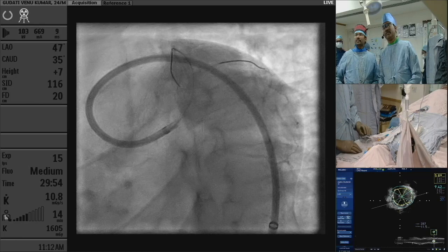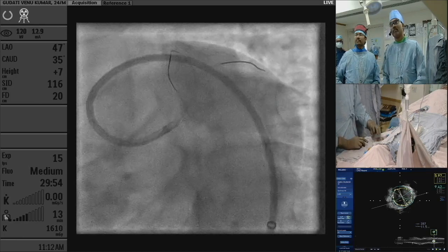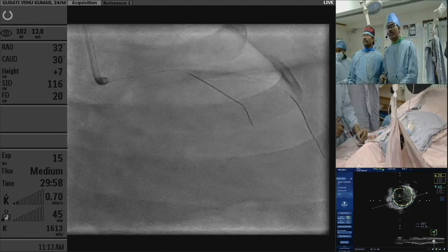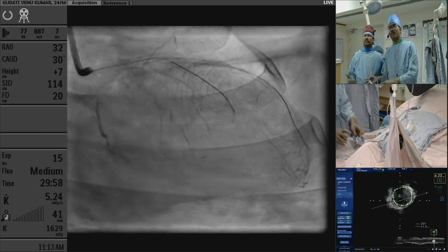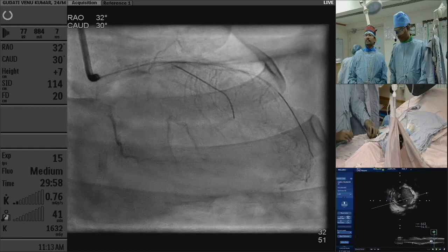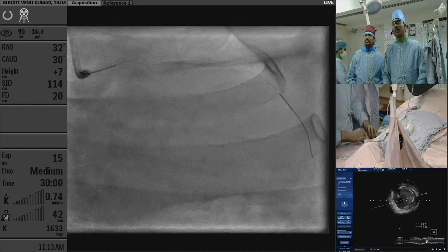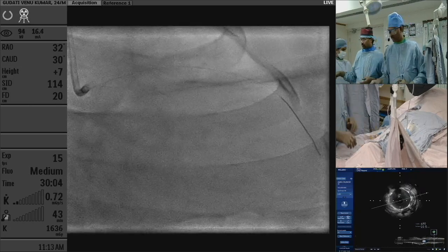That's fine. Oh, are you caudal? Okay. Out.